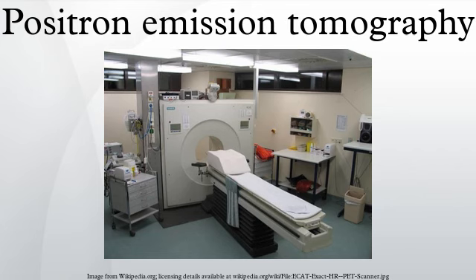Coincidence events can be grouped into projection images, called sinograms. The sinograms are sorted by the angle of each view and tilt. The sinogram images are analogous to the projections captured by computed tomography scanners, and can be reconstructed in a similar way. However, the statistics of the data are much worse than those obtained through transmission tomography. A normal PET dataset has millions of counts for the whole acquisition, while the CT can reach a few billion counts. As such, PET data suffer from scatter and random events much more dramatically than CT data does.